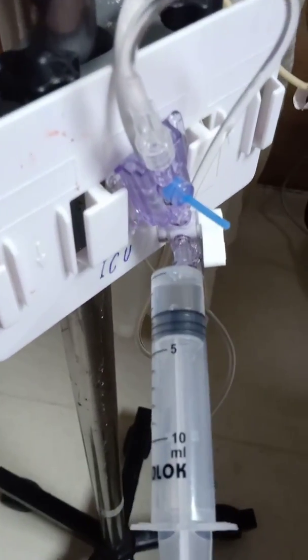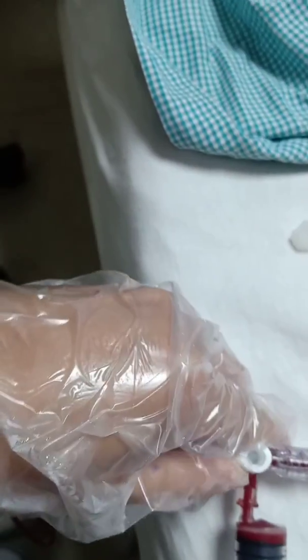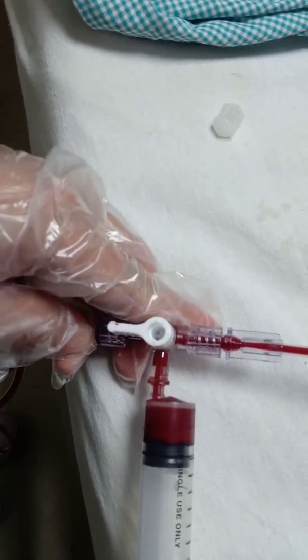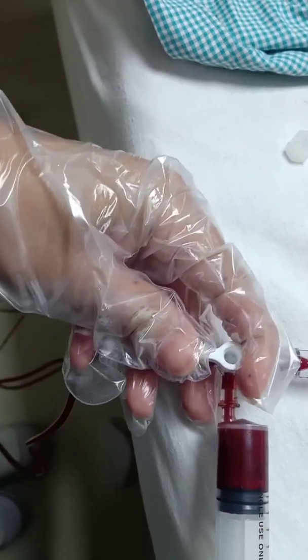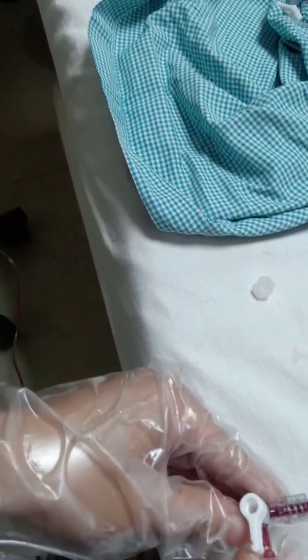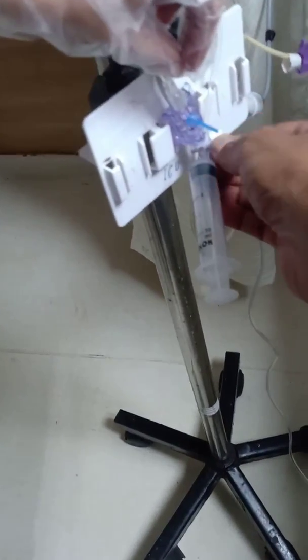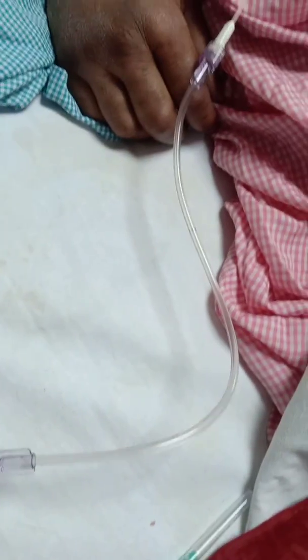The calculated dead space was around 1.5 ml, and as 3 ml of fluid has been withdrawn from the distal syringe, the blood has now traveled through the line and we are ready to draw a sample. We close the port to the other side, keeping it open to the arterial line, and take as much sample as needed. After the sample is taken, we close the port and push the discarded fluid back toward the arterial line to clear the catheter, then flush the system so the line becomes clear.